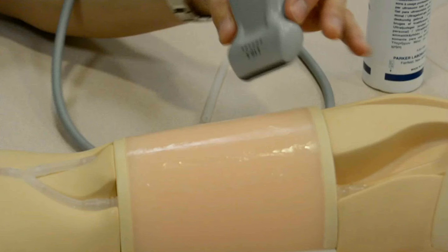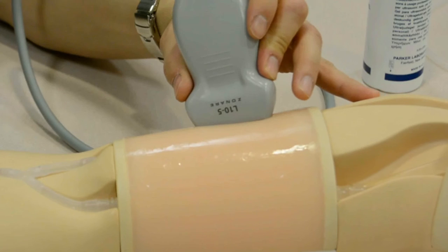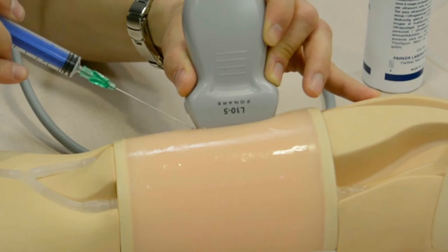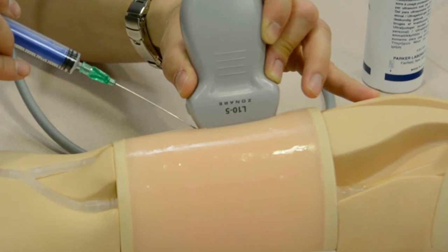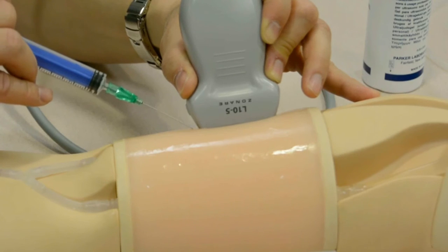This is how access is normally performed. We're going to go with the linear array probe, find the vessel in short axis, then rotate to a sagittal plane. With a sagittal view of the vessel we use an in-plane needle guidance technique. As we insert the needle through the phantom material, visualizing on the ultrasound screen, we advance the needle into the vessel and once we puncture the anterior wall we make sure we don't puncture the posterior wall.